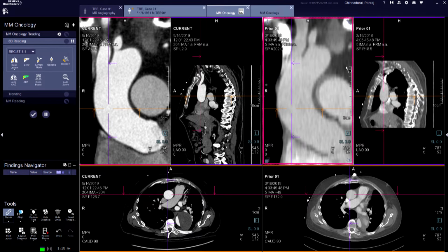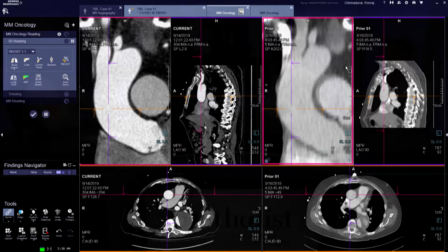And just to clarify, this is all done on Syngovia. Yes. Correct? So this is all done on Syngovia, and I'm doing it real time to show how easy it is to load those two data sets and let the algorithm take care of the comparison part. Even easy enough for surgeons to do? Yes, eventually. Remains to be seen. We're not the most patient lot.